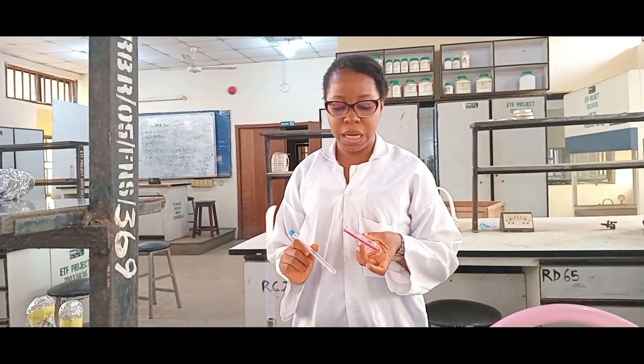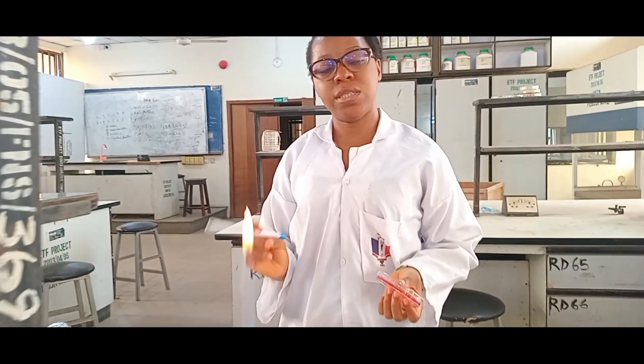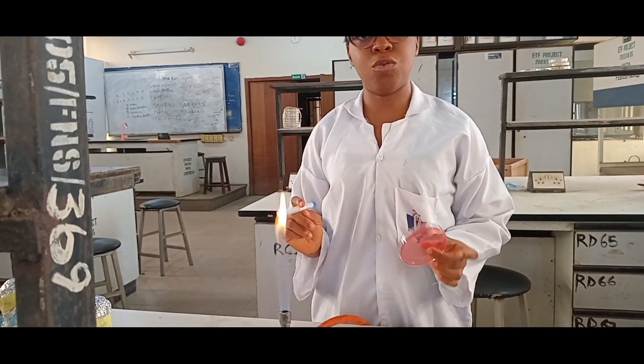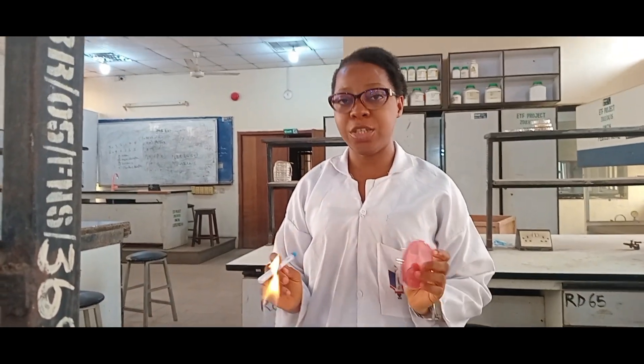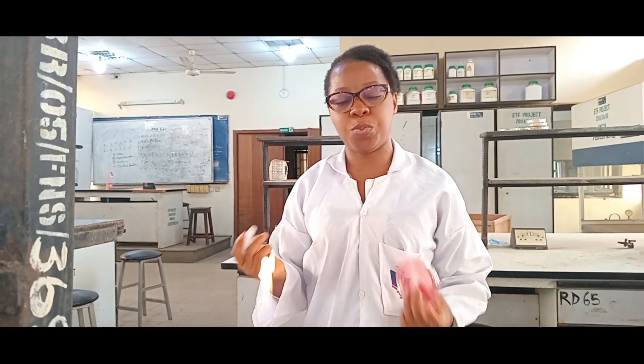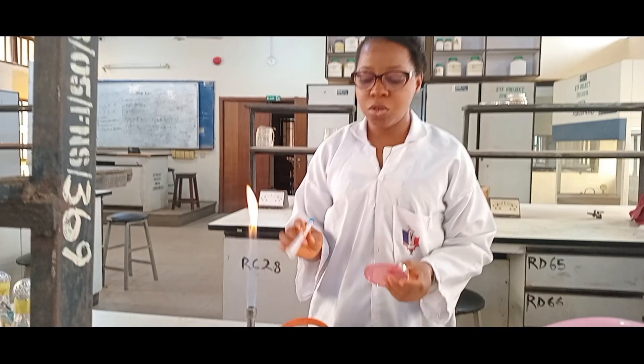This is Mannitol Salt Agar and it's a selective media for Staphylococcus aureus. Staphylococcus aureus is always golden yellow on Mannitol Salt Agar. Other types of Staphylococcus species will also grow but with different colors.